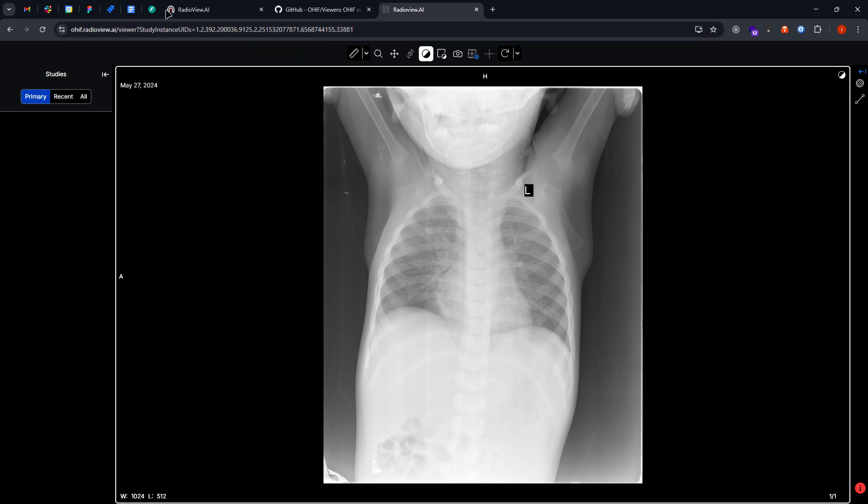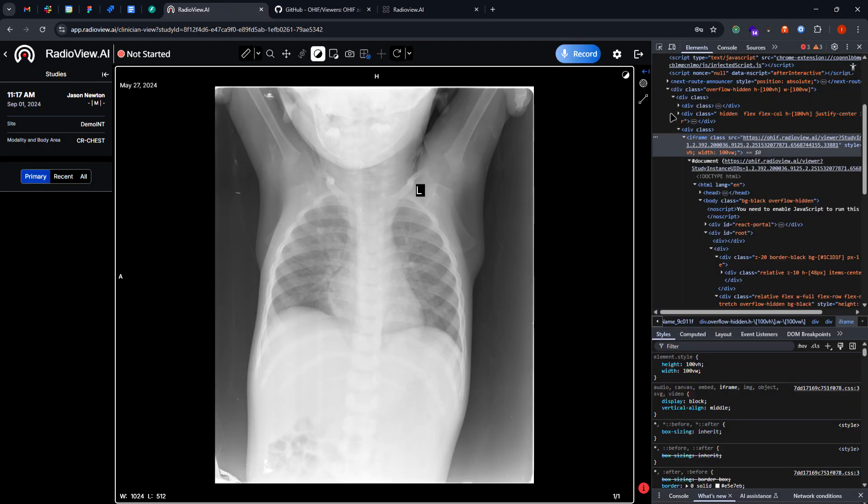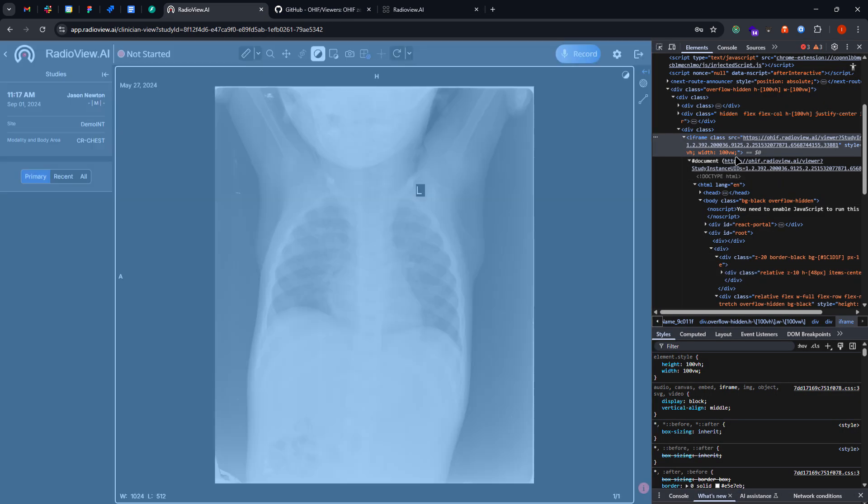And you can see that this is deployed in another URL, and inside of our host application we are using the URL inside of this iframe.